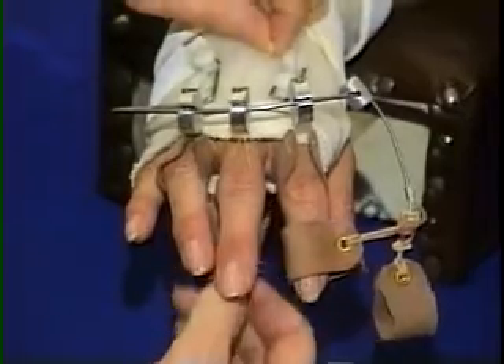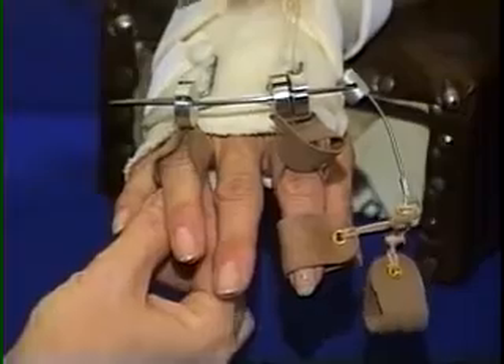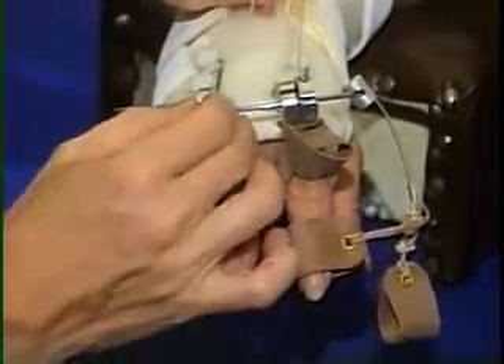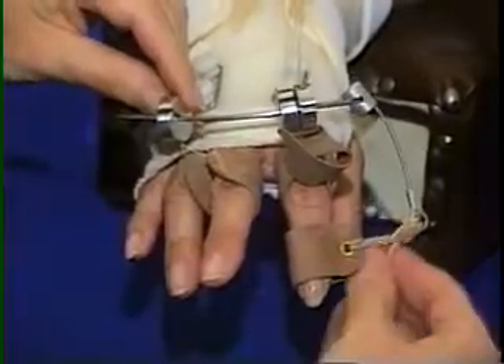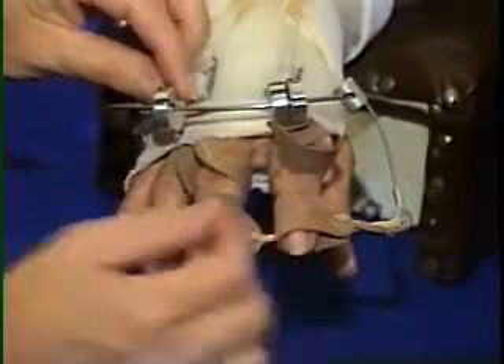If a more extreme angle is desired to rotate a digit, the line to a cuff can cross over. To spin this middle finger MP, the cuff from the third wheel is used. This frees the second wheel for fitting to the ring finger. The lines are crossed with minimal resistance to flexion.